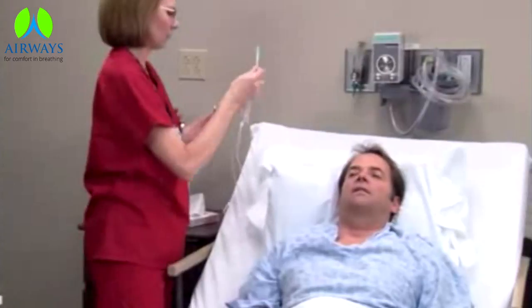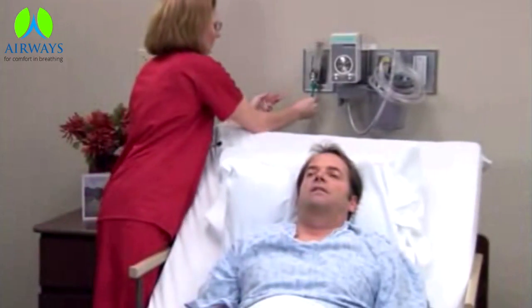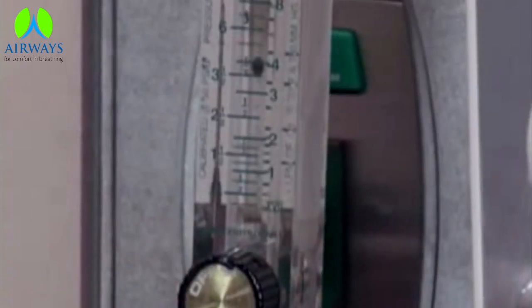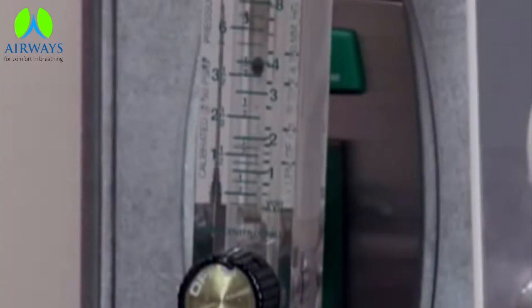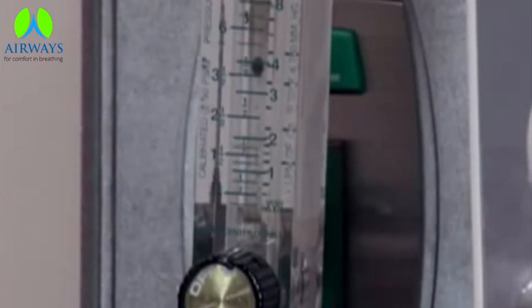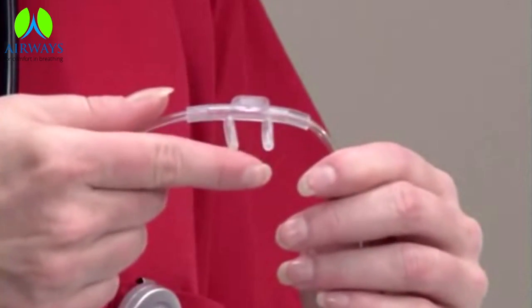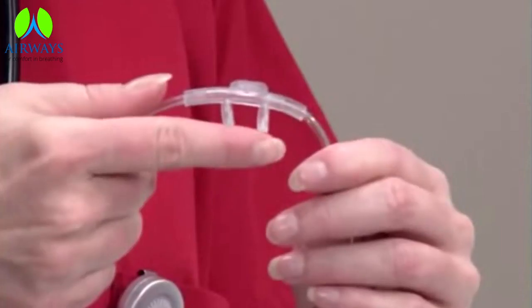Check that it properly fits the nasal cannula. Adjust the flow of oxygen as per prescription. Also check that oxygen is flowing in the oxygen delivering device.